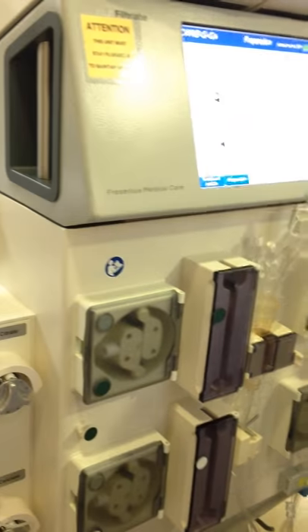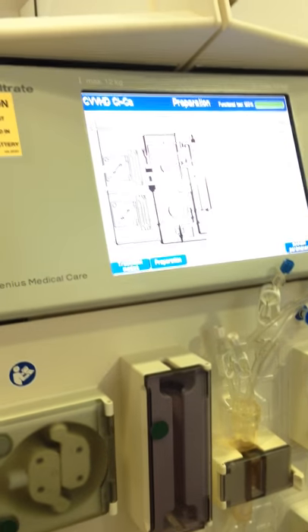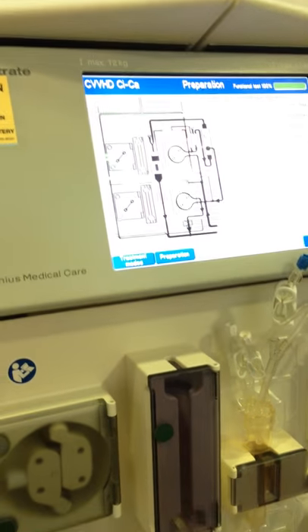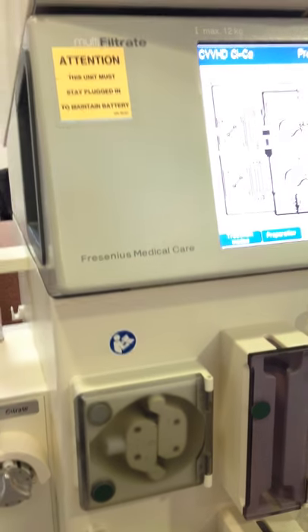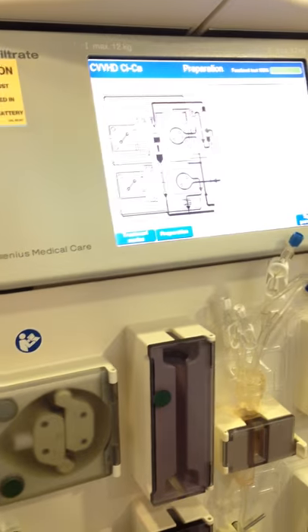Pressure. All right, now rotate. Green is your dialysis. Which is calcium? Zero calcium, free. So where should we place the dialysis solution on the dialysis line?